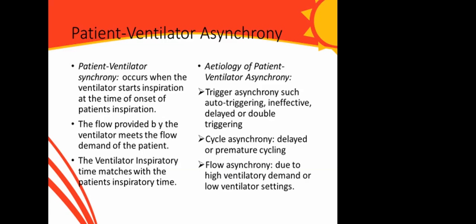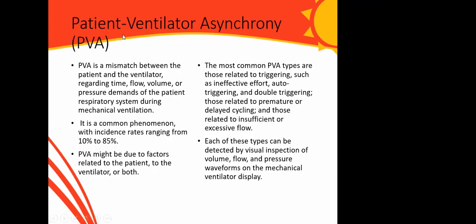A lot of times, patient ventilator asynchrony may go unnoticed, and you need to be very careful, because what you want is for your ventilator and the patient to work in tandem to meet what you have in mind. But when we talk about ventilator asynchrony, it's actually a mismatch between the patient and the ventilator, and it occurs during time, flow, volume, or pressure.